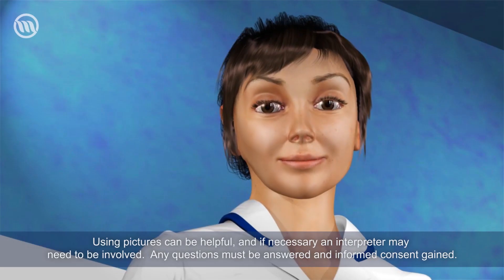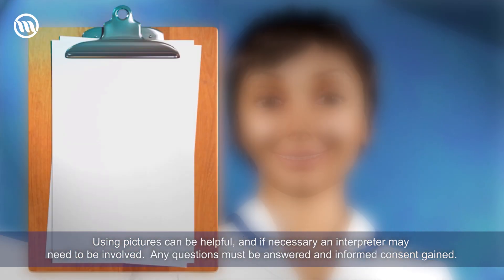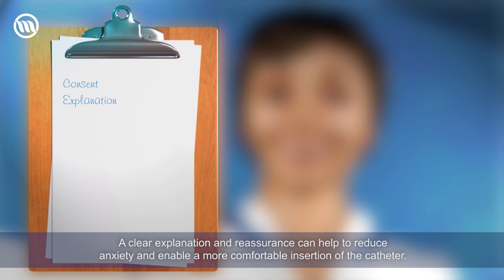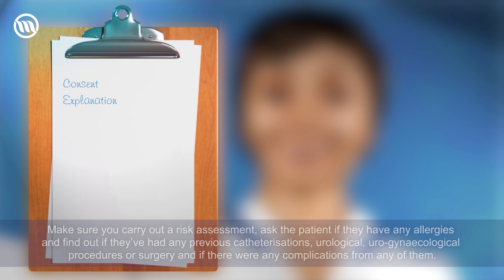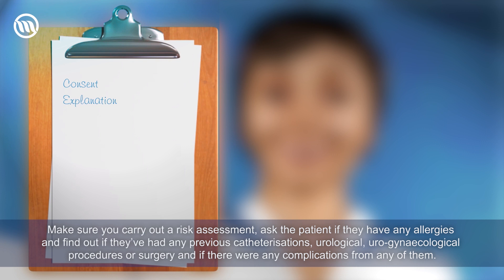Any questions must be answered and informed consent gained. A clear explanation and reassurance can help to reduce anxiety and enable a more comfortable insertion of the catheter. Make sure you carry out a risk assessment.